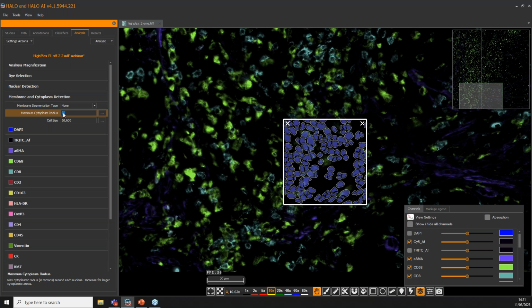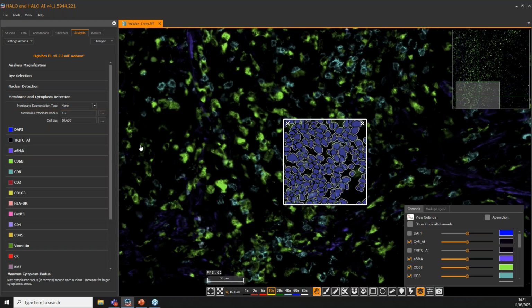So I did write 1.5, but for some reason, it takes a bit of time, and it always does when you're presenting a webinar, obviously. So please forgive me for that and give me a couple of seconds just so this comes back. All right. Oh, perfect. I have to keep faith. Okay, so now we have the cytoplasm radius that has been drawn here, and basically it has the radius I've just inputted here.